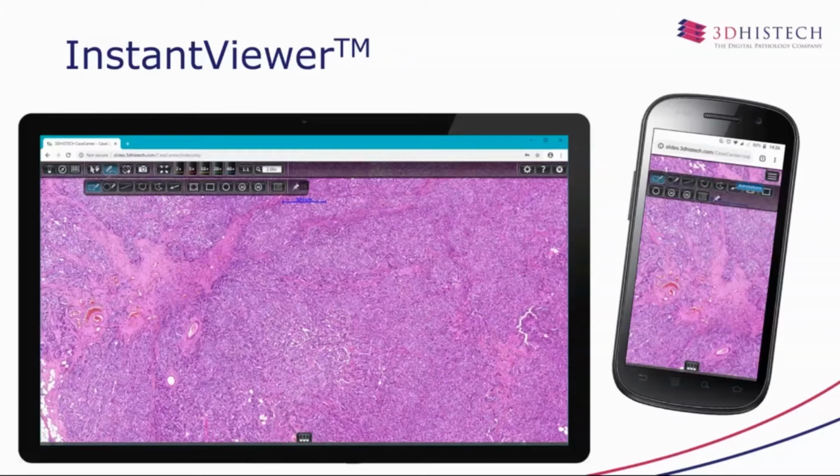On this slide, I would like to show you 2 screenshots about the instant viewer. The bigger one was taken on a desktop setting, and the smaller one was taken on an Android-based mobile phone. Basically, if you have a recent browser, then you can use this viewer.